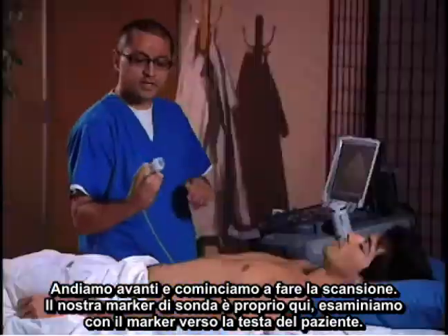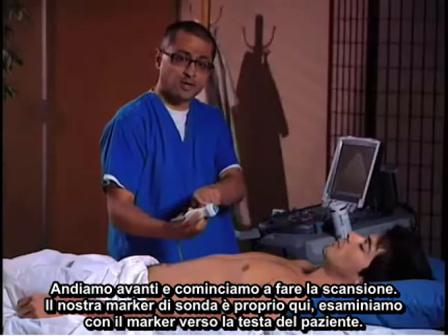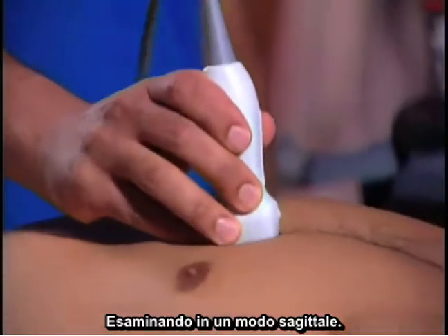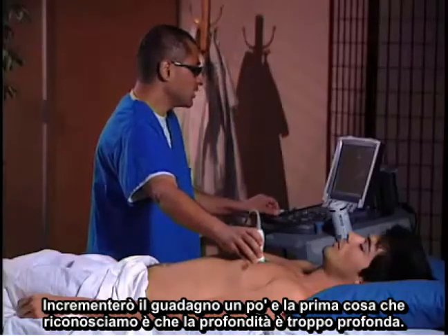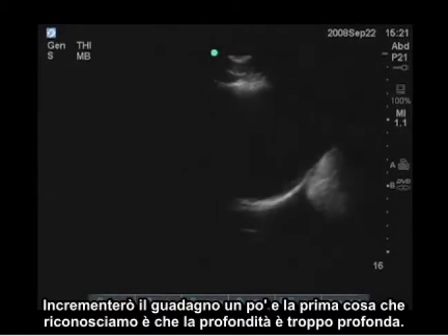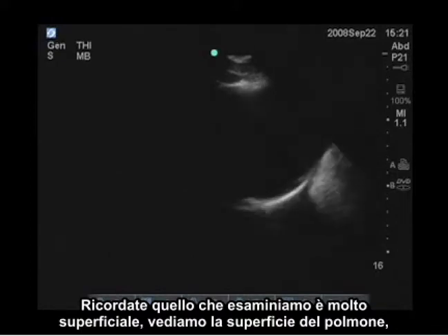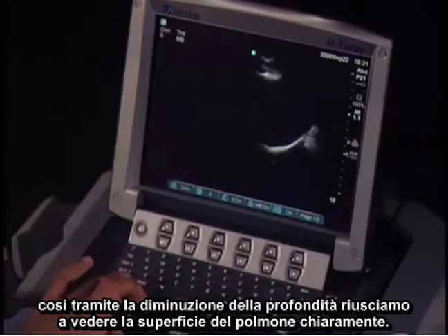We're going to go ahead and start scanning. Here's our probe marker, aimed toward the patient's head, and I'm scanning in a sagittal fashion. I'm going to turn the gain up a little bit. First thing we recognize is that our depth is too deep — what we're scanning is really superficial, we're looking at the lung surface, so I'm going to decrease the depth so we can see the lung surface easily.